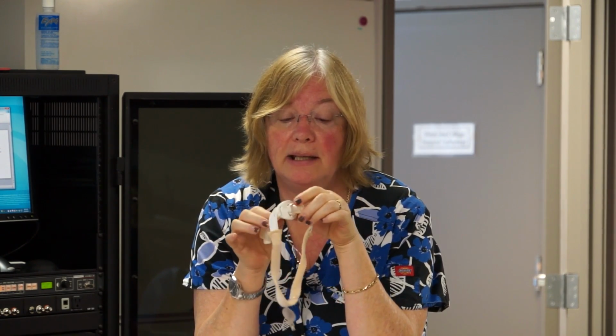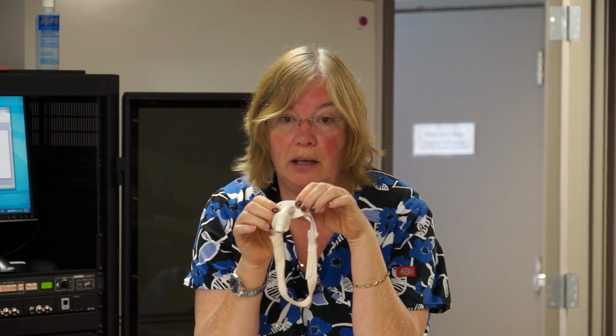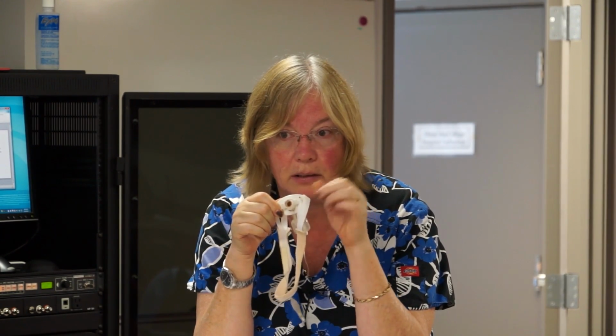With the cuffless one, can they speak? Yes, they can. So if that cuff is a little bit deflated, they'll be able to speak as well? If it's completely deflated. The trach is determined by the size of the patient. This is a number 10 trach. It's a huge trach. So if I have a really small person and I were to put this in my patient, then I would completely occlude their trachea. We want a little bit of play in there so that this does not hit the side walls of the trach. There's going to be a little tiny bit of a gap. So then when we inflate it, this is barely hitting the side walls and it's occluding it, so the air only goes in and out through the trach.